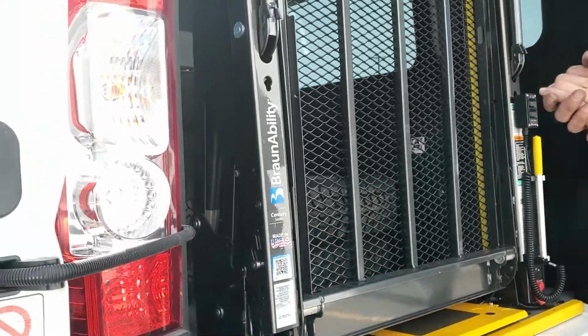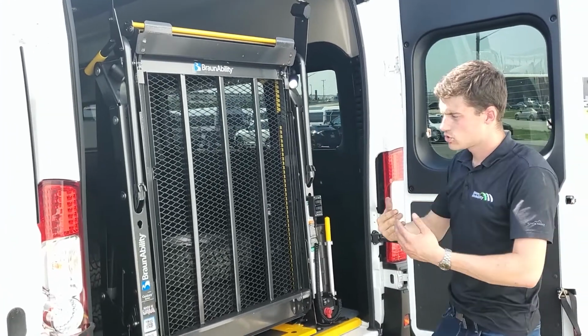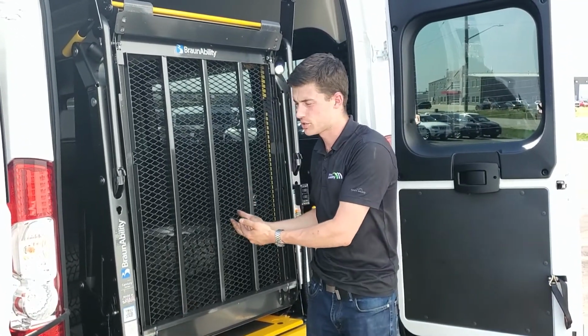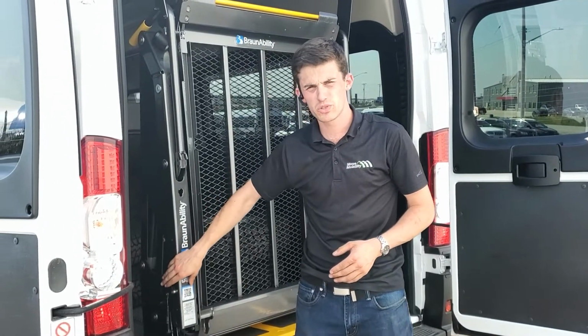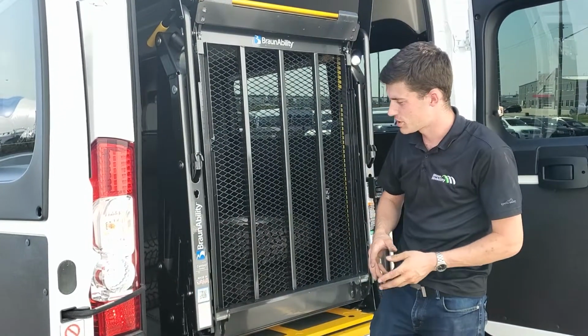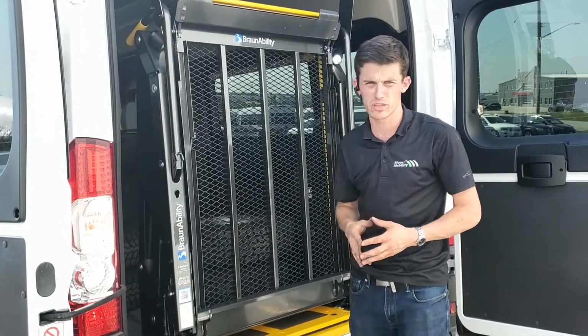What that does is prevent the lift from resting on the doors, so when you open the doors, the lift is not coming crashing out because there's nothing holding it and there's no hydraulic pressure. So these do have a function, but not to be used during transportation. And that's the biggest thing we can share with that: not to be used during transportation, because you will damage other safety components of the lift.